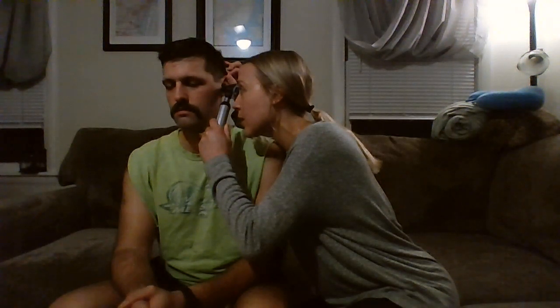It is intact. We can see, since I'm looking at the left ear, the cone of light is at 7 o'clock. We can see the umbo, the incus, and the malleus, the bony process there. And no note of any effusion. Again, tympanic membrane is pearly gray and intact.